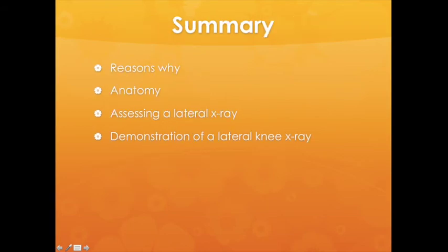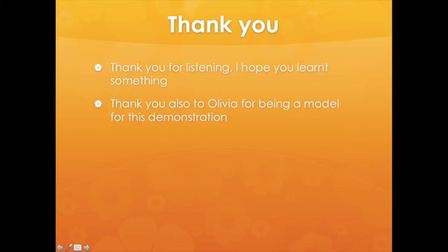A summary of what we have learned. We've learnt the reasons why we perform a knee x-ray. We've learnt the anatomy of a lateral knee x-ray. We've learnt how to assess a lateral knee x-ray and why it's important. And we've also learnt the demonstration of a lateral knee x-ray position.